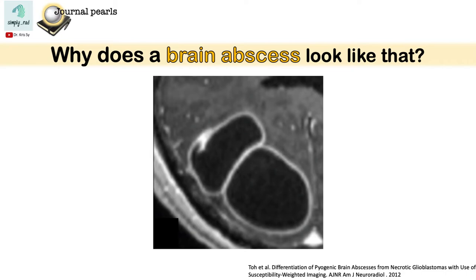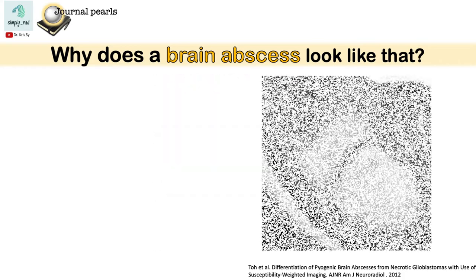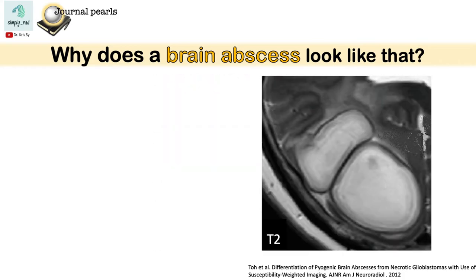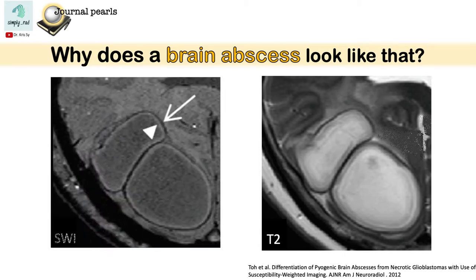Let's start with these two rim-enhancing masses on the right occipital lobe. When we look at the same lesion on the T2 image, we see that the margin has a hypo-intense rim. And on SWI, we see two layers of this concentric rim.